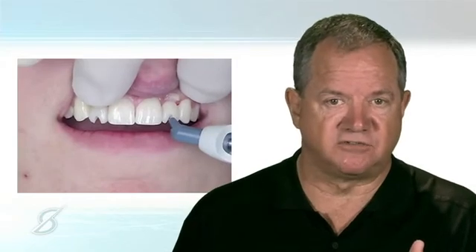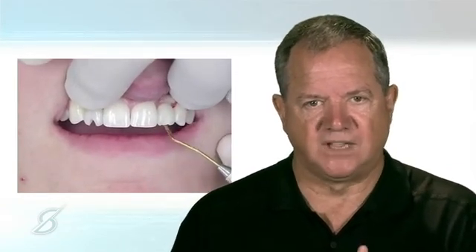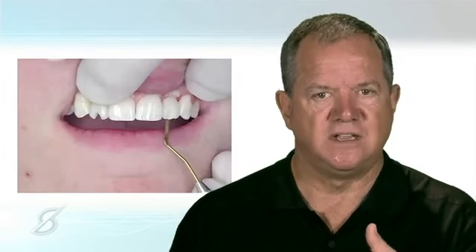So when I fill in the screw access holes, I just typically throw a little cotton pellets in there so that I know the screw isn't going to get filled with composite, and then go ahead using a body and enamel colored composite, and these temporaries happen to be made out of composite onto an opaque temporary abutment. And one hint about closing off screw access holes is if you want them to look good, if you have an opacious dentin composite, which is what I'm using right now, I put that opacious dentin composite in the screw access hole and on the lingual, so I can then veneer it on the facial with some dentin or enamel.